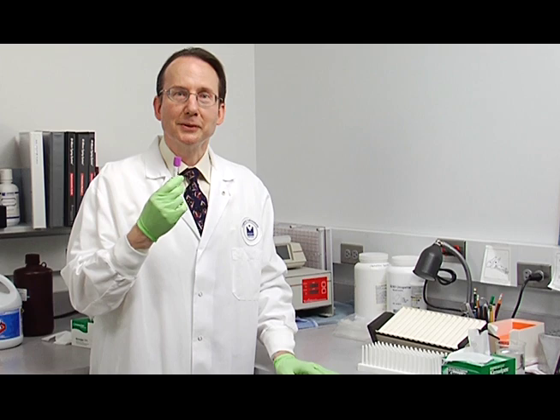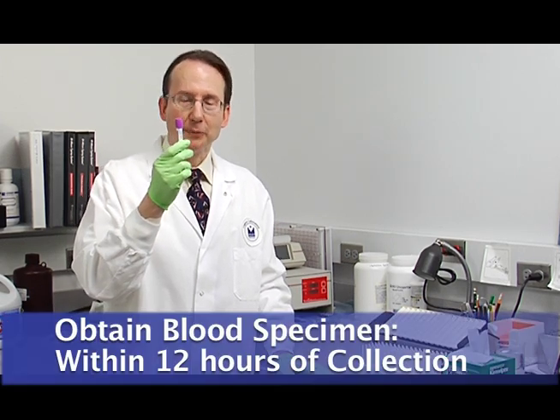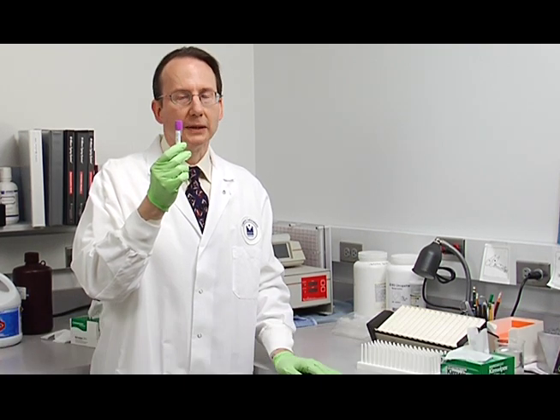The next step in performing a manual cell count is to obtain a blood specimen. This is an EDTA blood specimen. You want to get a specimen that's no older than 12 hours from collection.